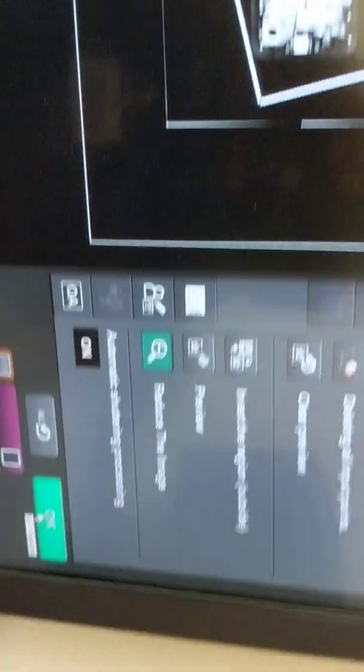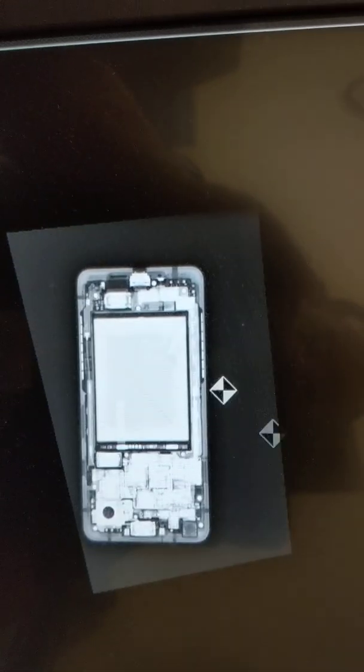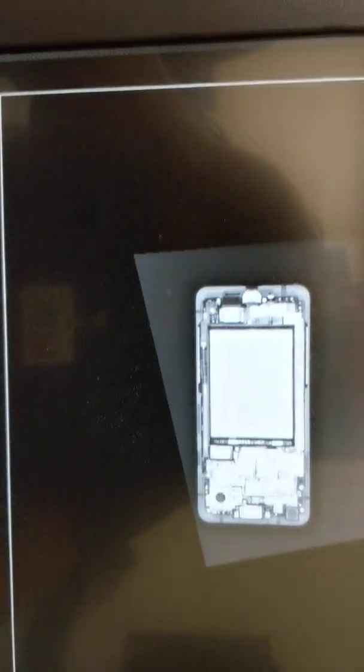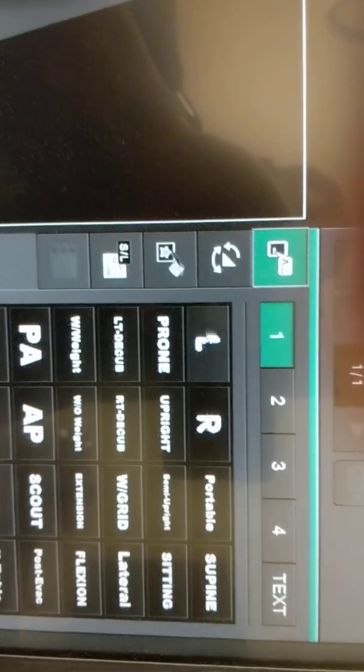And you hit OK, and I cropped it. It's kind of hard to see. If I use window width, you'll be able to see it better. That's the background of it being cropped. You could rotate the image in 90-degree angles.